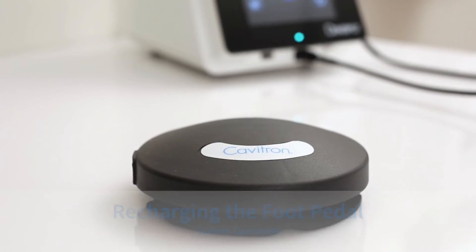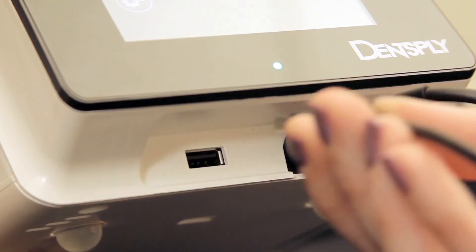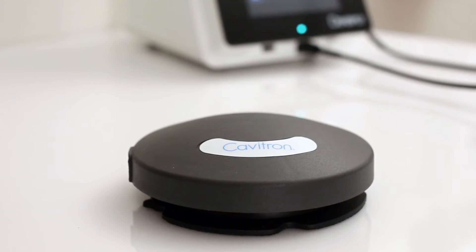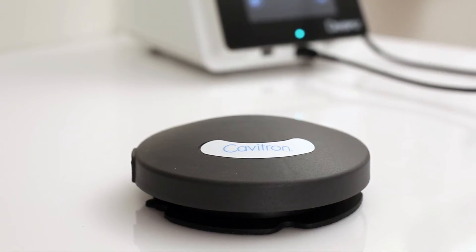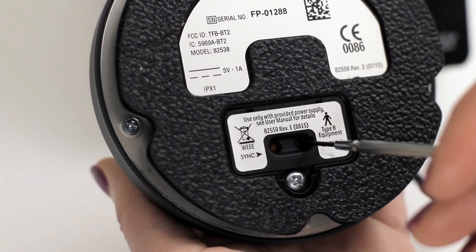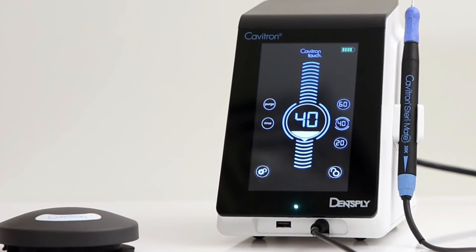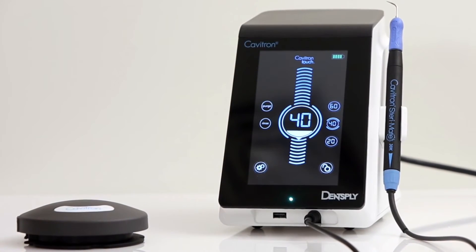Recharging the tap-on foot pedal: With the unit powered on, plug the auxiliary foot pedal cable into the foot pedal and the USB port on the front of the unit. The foot pedal is packaged with the power off. The foot pedal must be turned on prior to use. The foot pedal will not charge in the off state. To turn on the foot pedal, press and hold the power button for 4 seconds. Allow the foot pedal to charge up to 4 hours to achieve a full battery charge, which will be visible by the battery charging icon that appears on the screen. The unit will operate with the foot pedal while the battery is charging.